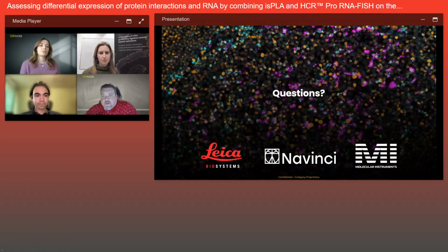Thank you. This next one will go to Sara. Can the isPLA be used on frozen or FFPE tissues? Yeah, so our assay can be used on both types of sample, but it's good to test first, obviously, because we found that some antibodies don't work as well on fresh frozen, for example. So definitely can be used on both, but definitely do some optimizations and tests first before committing to a large number of samples.